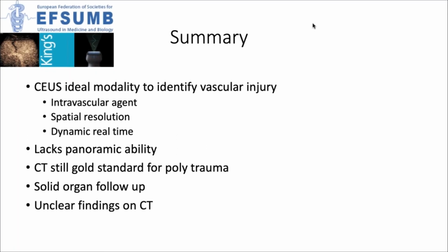And we have to acknowledge that CT is not perfect. We will see focal fatty sparing, we will see incidental findings, we will see perfusional abnormalities. And a contrast enhanced ultrasound can simply be performed either at the time of CT or at the bedside immediately after for the patient, and rule these out as potential injuries.